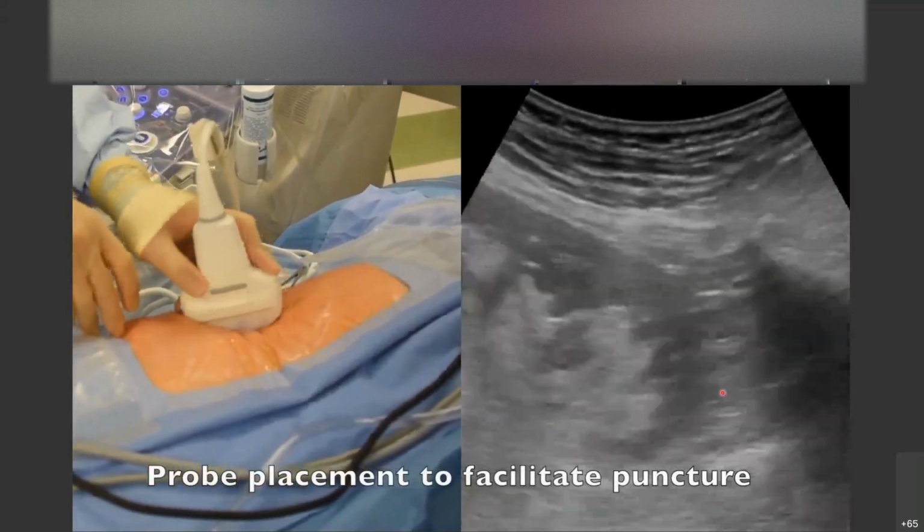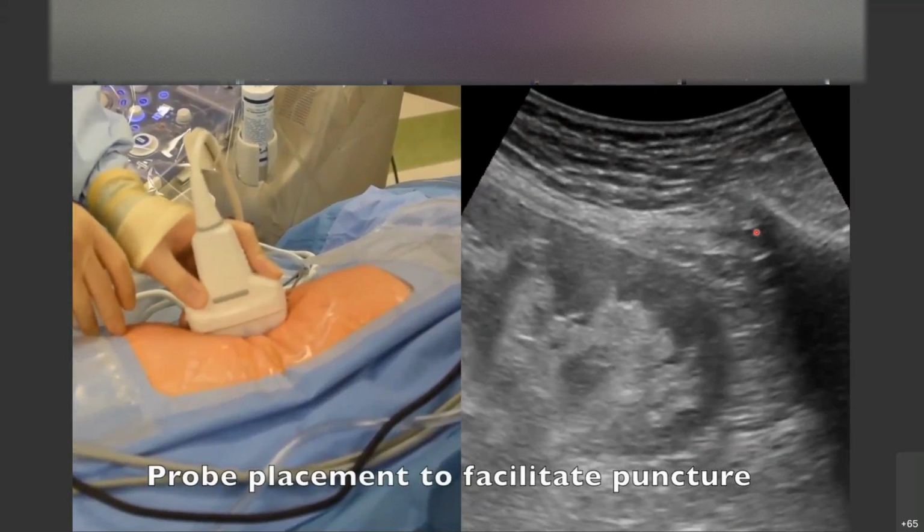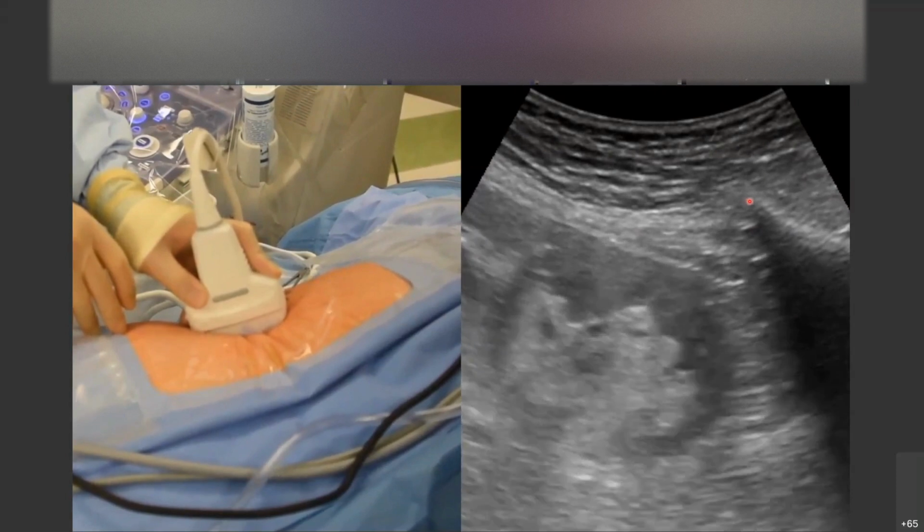So if we were going for a lower pole puncture, we'd move the probe down towards the hip. If the hip is in the way, you'll see the shadowing and you may not be able to get your needle position where you want it.